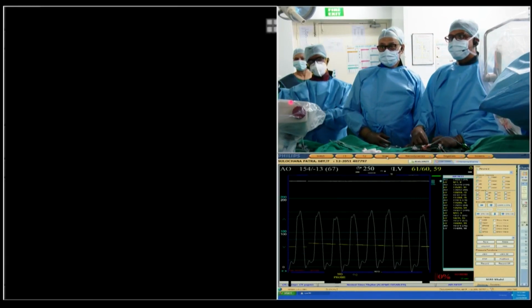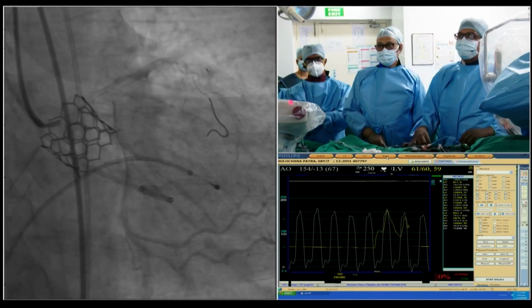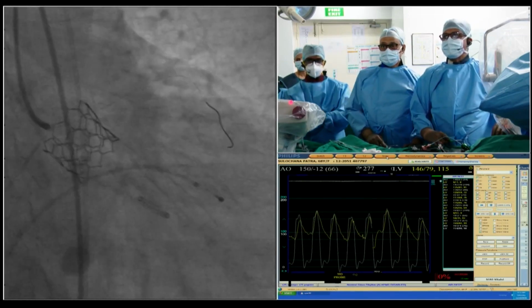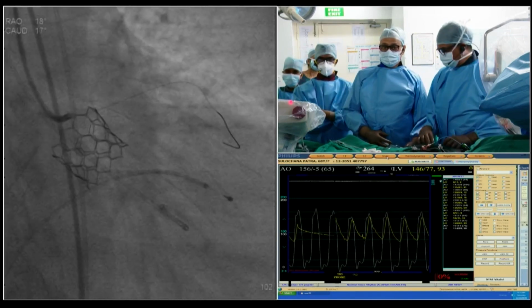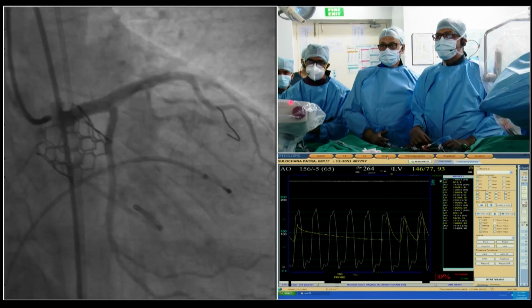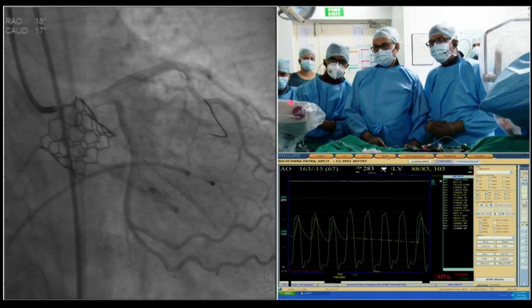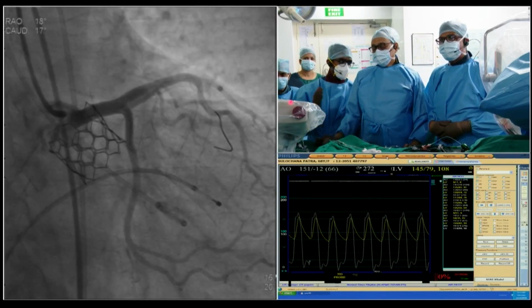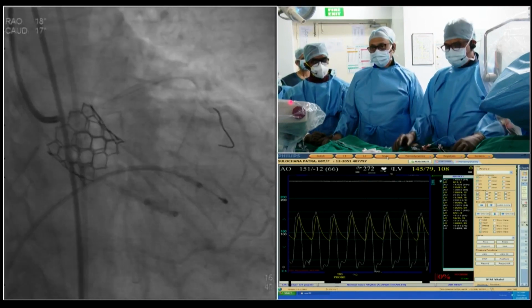Right, okay. And inject. Now that's because the guide liner is there. I'll take another picture. Okay, now it is better. I think it looks quite good, right, Anil? Yeah, it looks good. So would you, if any, leave this just to Dr. Andreka?